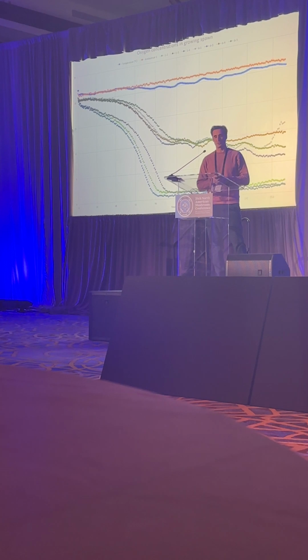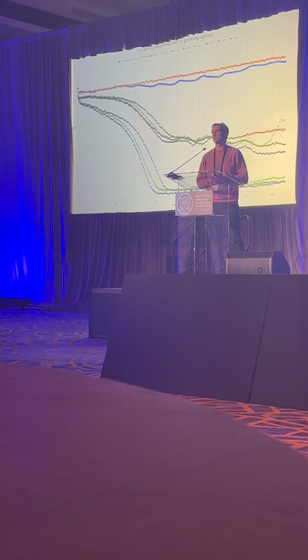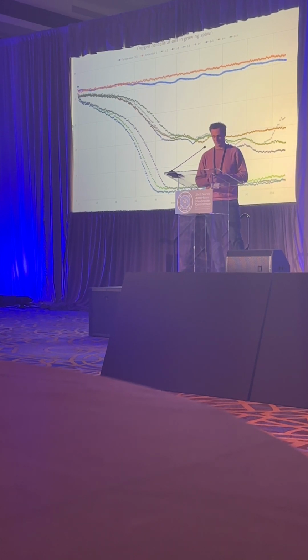Okay, same fluctuations for the 6 filtered bags. They are not as pronounced in the 1 filtered bags. And you can see the ambient air plot, which is the orange up top, consistent at about 21%. So for us, that means that what we are measuring is actually correct because we have that ambient air sample.